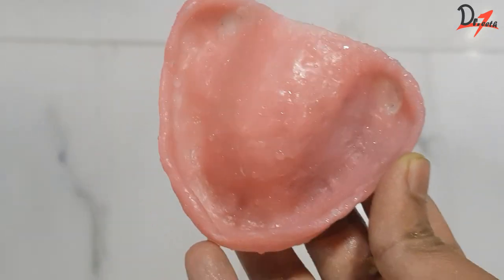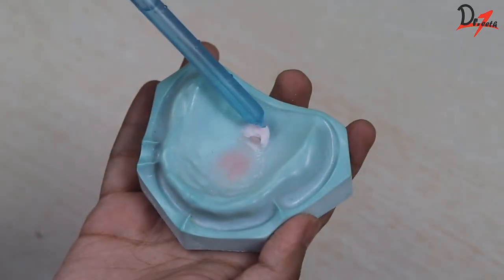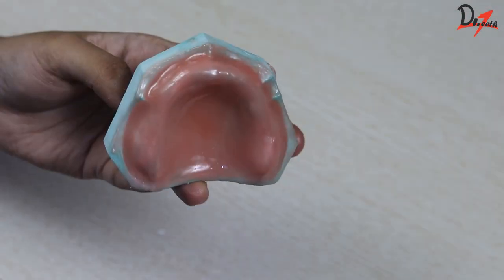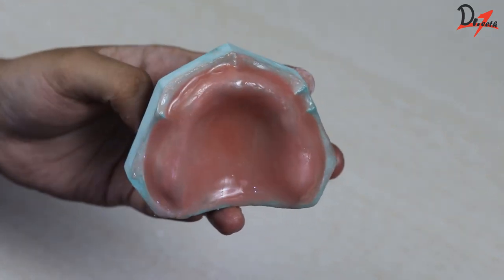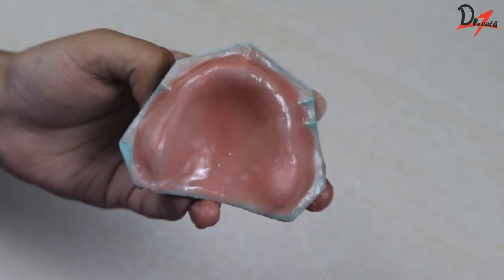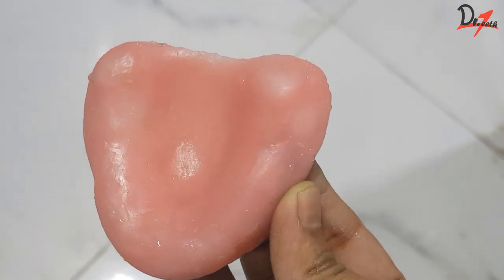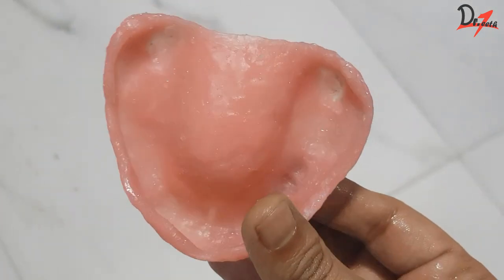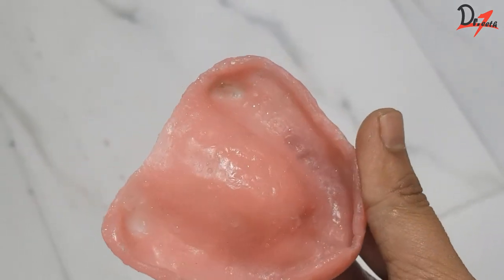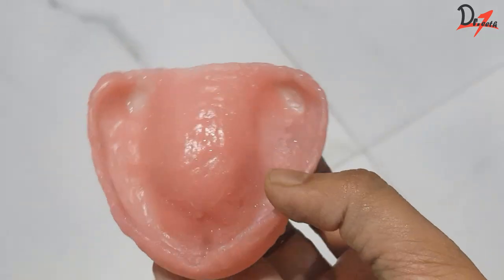The denture bases can be made with auto-polymerizing acrylic either using the sprinkle-on technique or the dough technique. The sprinkle-on technique provides better adaptation but it is a time-consuming process. The dough technique is simpler — one method is finger adaptation, but adapting the material in the sulcus can be a bit difficult. In this video, we will be seeing an easy method to use both techniques to make record bases.